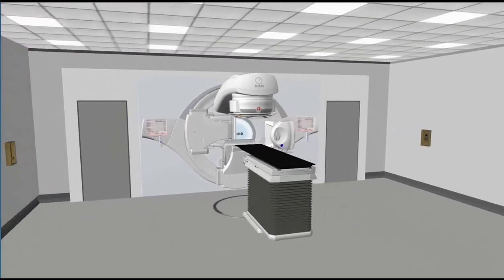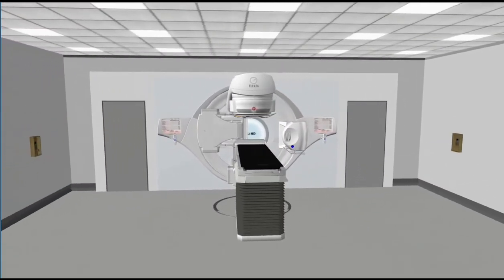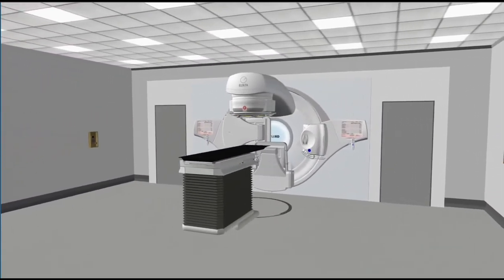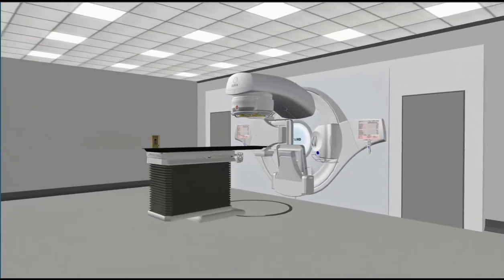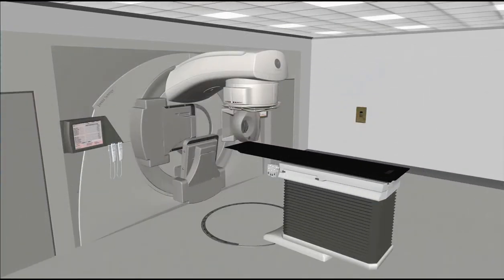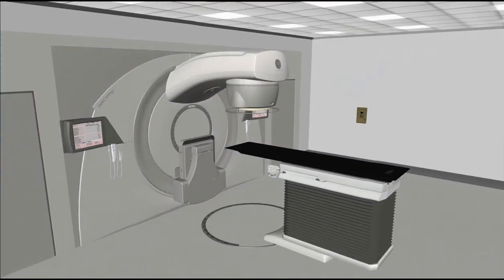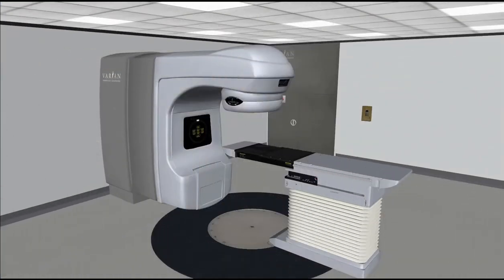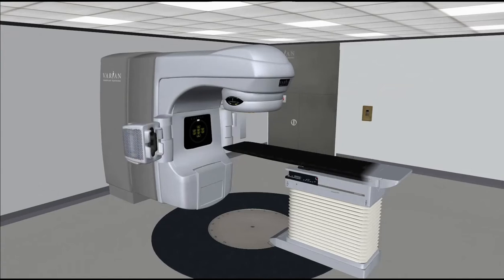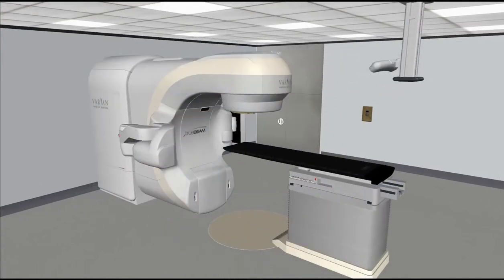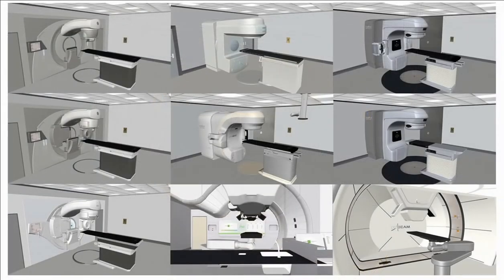VIRT is the market leader in virtual reality simulation training for radiotherapy education and patient education. Within the VIRT system, all the major vendors are encompassed, set within an exact replica of a clinic room. VIRT offers a range of accelerator models such as Elekta, Siemens, Varian, and the more recent additions of the Varian ProBeam and IBA.